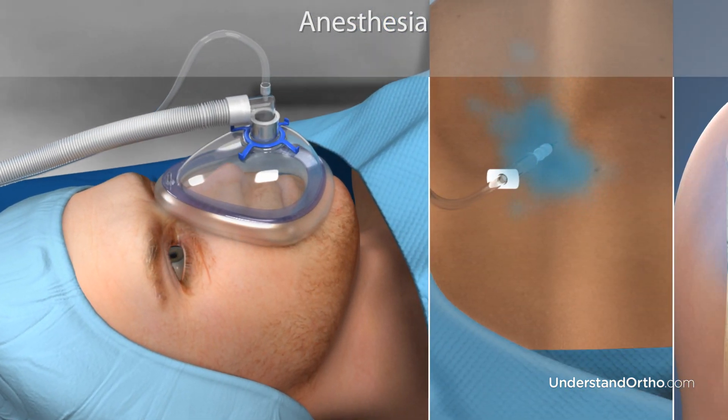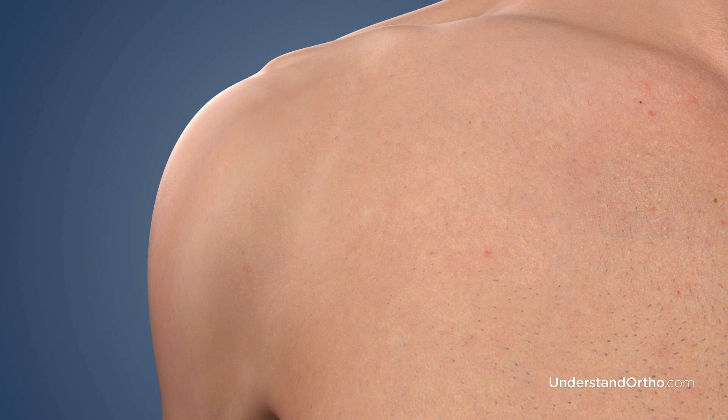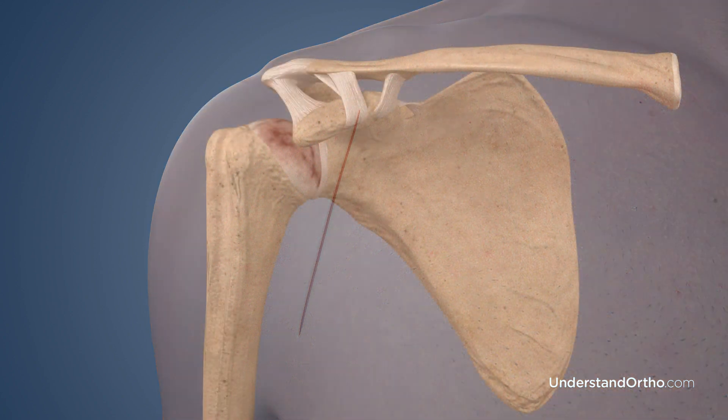Your anesthesiologist will determine whether to use general or regional anesthesia and/or a nerve block. Total shoulder replacement surgery typically lasts between one to three hours. Your surgeon will make an incision to access the shoulder joint.